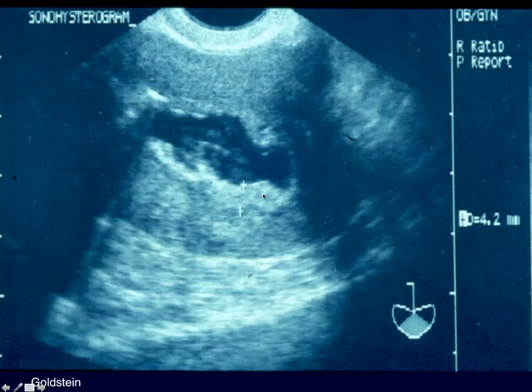So here's a woman who's 18 days from her last bleeding episode. And we put some fluid in there. You can see some of it twirling around. You know, is this focal hyperplasia? Is this a small polyp?